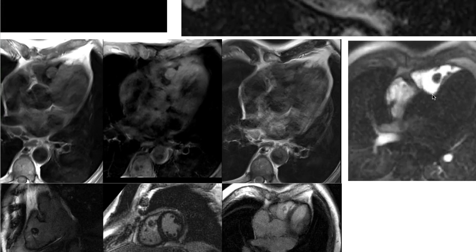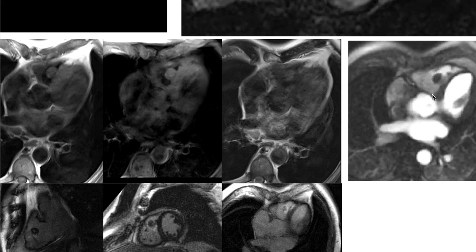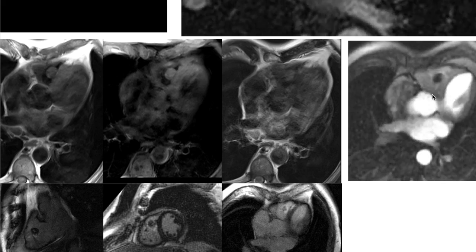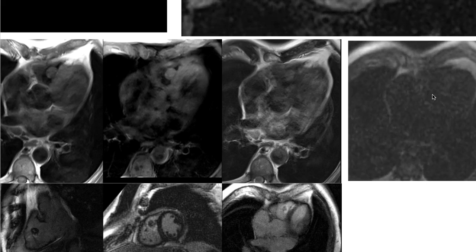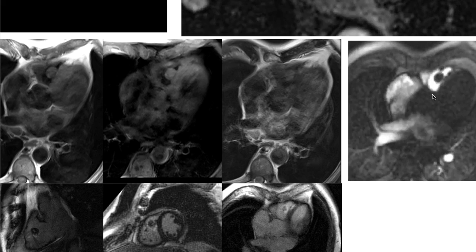If we look at our tissue characterization sequences, we have T1, we have T2, so pretty homogeneous on T1. It looks to be a little bit brighter on T2. This is our T1 post-contrast enhancement. Kind of tough to say whether this is enhancing relative to that. Image quality is not great here.